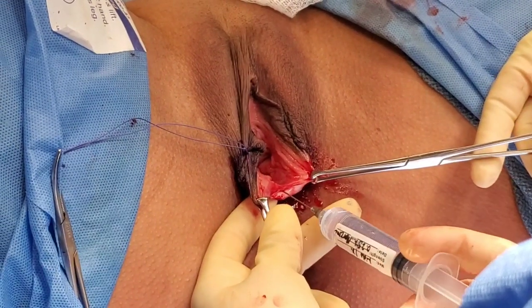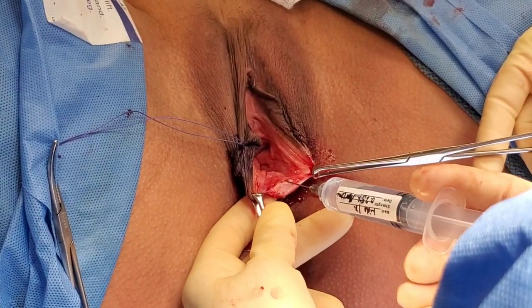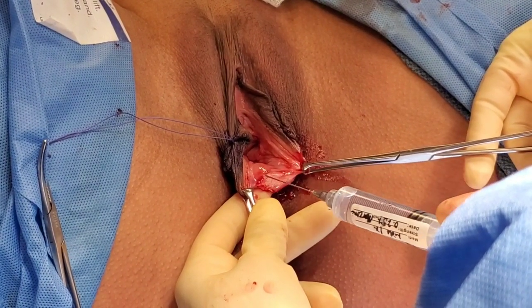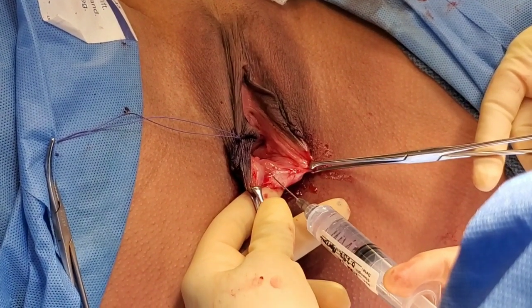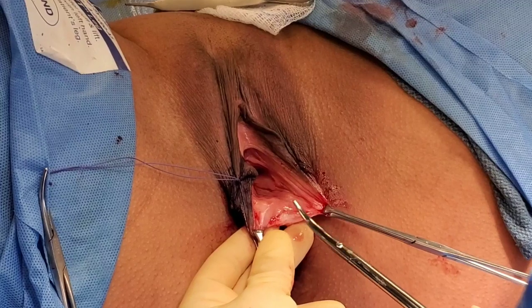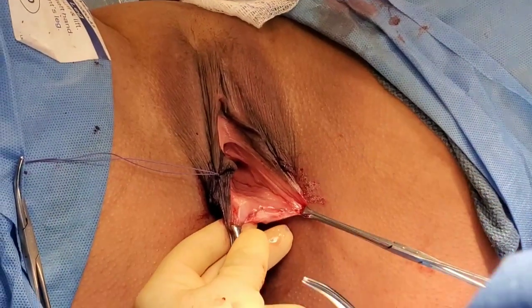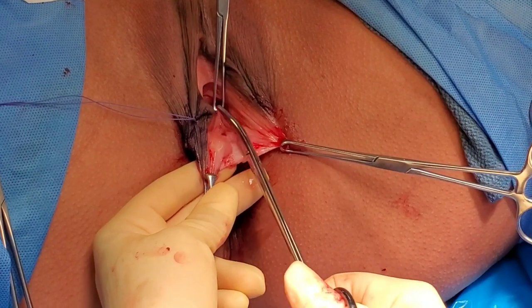What I'm doing first is called hydro dissection. I'm going in the layer between the vagina and the rectum, because you have to be very careful — if you're making cuts in this area, you do not want to get into the rectum. This hydro dissection helps me separate the layers, and at the same time helps with hemostasis and pain control. Then I come in very gently with what are called Metzenbaum scissors — they're very delicate scissors. You can see I'm staying very superficial until I get to that area of indentation, just dissecting, and then I make my cuts.